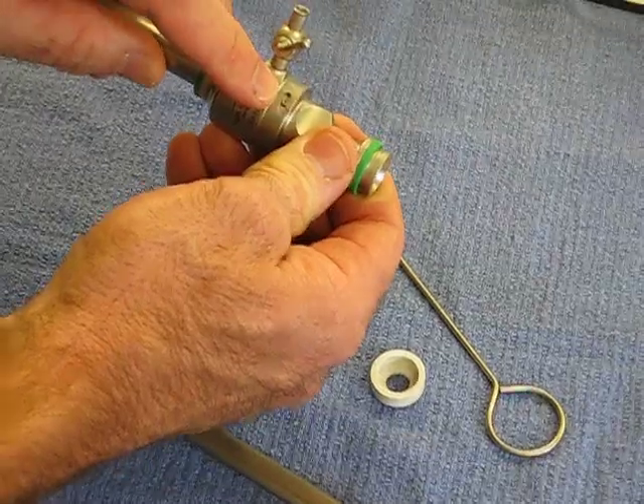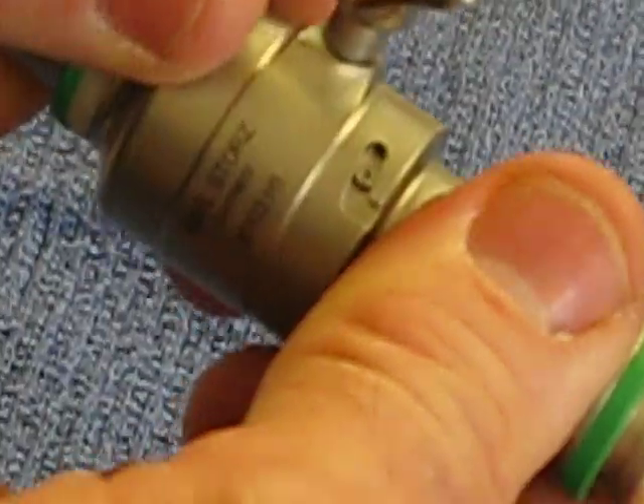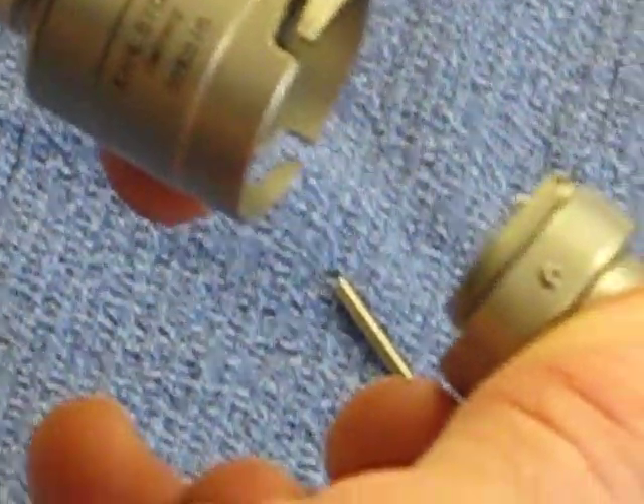This notch here is what locks the automatic valve to the barrel of the cannula. You want to rotate that until it's open and slide that out.